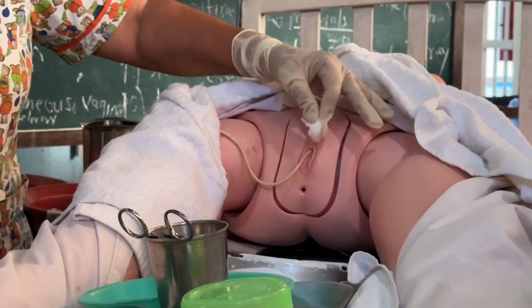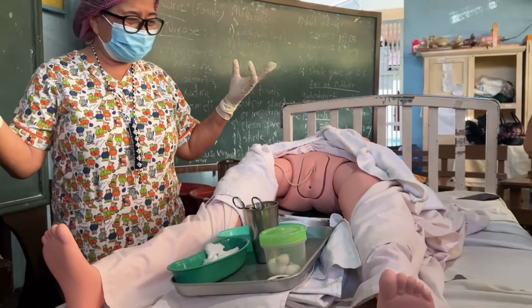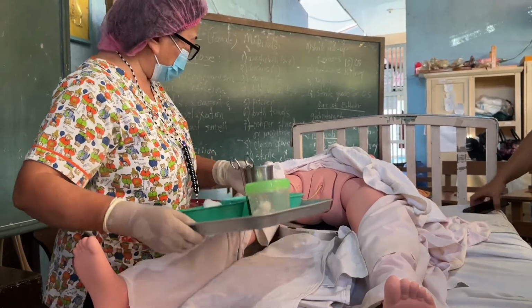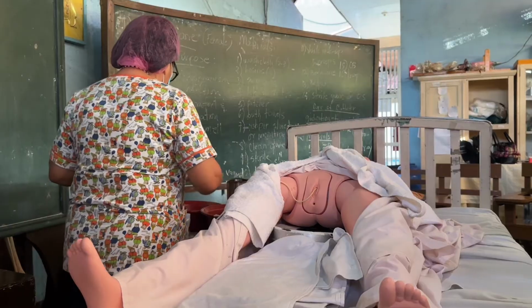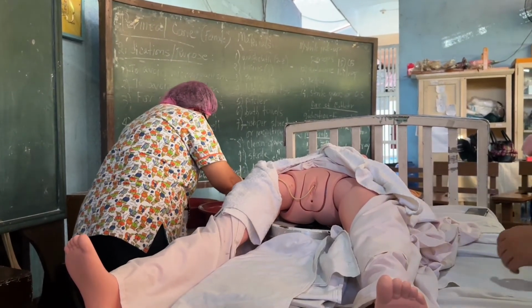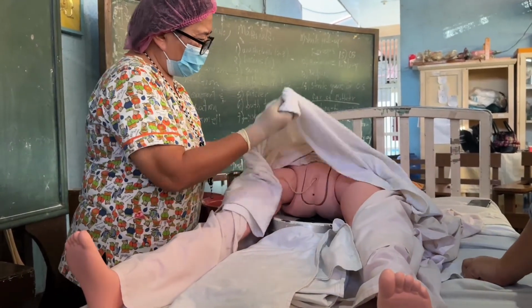So, kita na. Okay, I'm done. So, put patient comfortably on bed. So, remove everything after here.